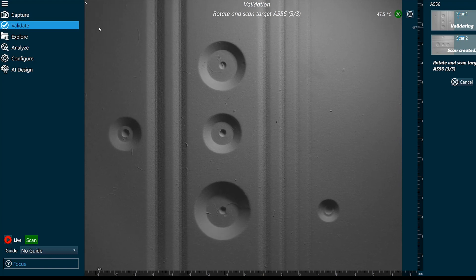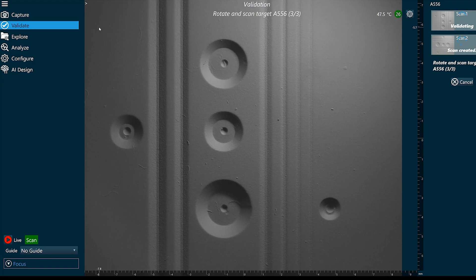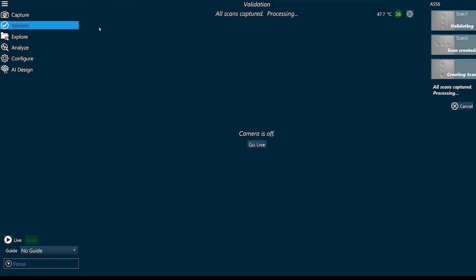When I capture these scans, if my images look blurry I can focus the system. We have access to autofocus in the bottom left corner.